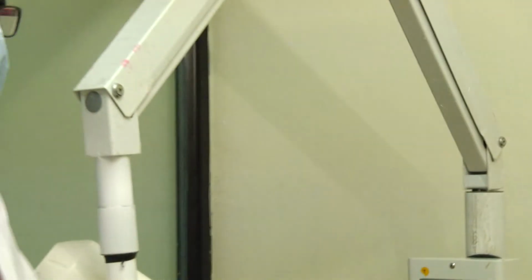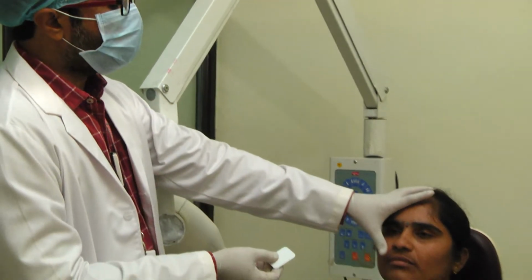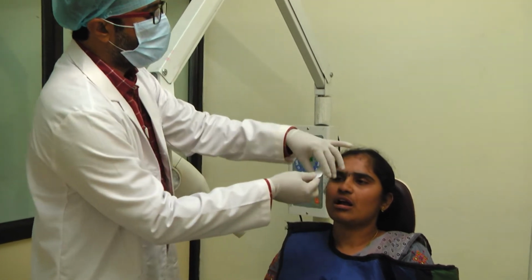And coming to the maxillary canine, again for the placement of the film, exactly the region of the tooth should be in the center of the film.